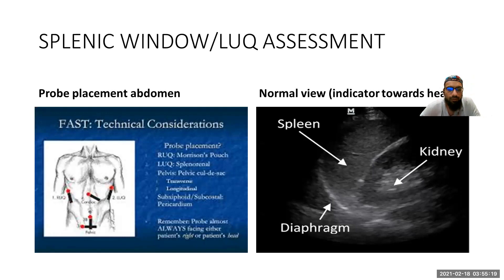So we've seen this before — this is where we place our probe, in the sagittal plane, basically along the side of the patient's ribs, with the indicator pointing towards the head. Your spleen is sitting just around there, and then you've got your kidney towards the middle. If you get a good view, you would see the spleen over there — this is the lateral side, closer to your probe — and your left kidney as well. You would see the diaphragm, the spinal stripe, and the same mirroring effect. It's very important to know the anatomy.